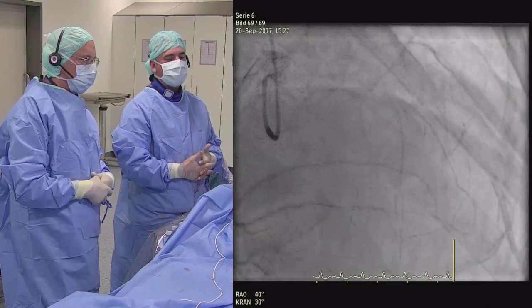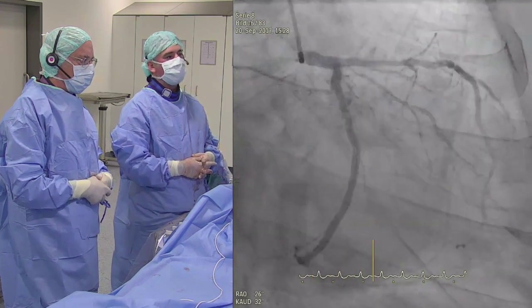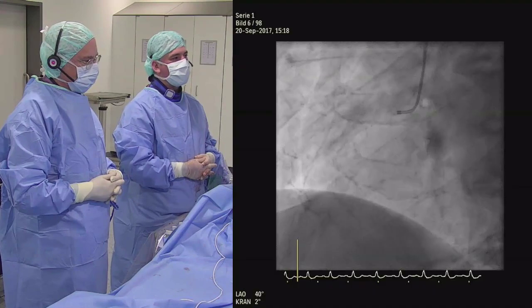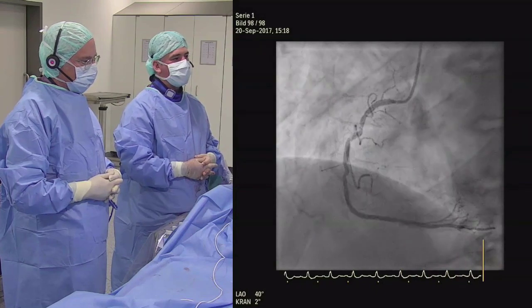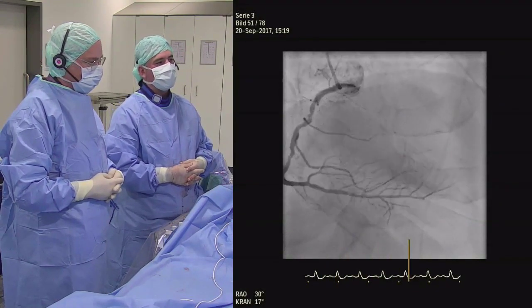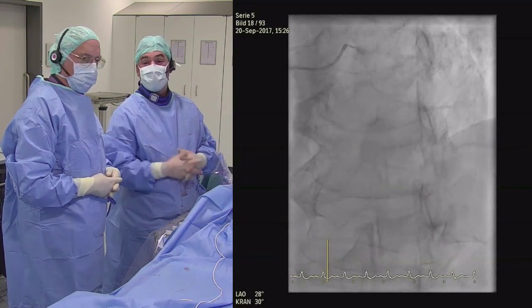To make a long story short, all of these optical transducers are basically produced in Quebec City, believe it or not. There are basically 3 companies at this time using optical transducer and optical fiber to transmit: the ASIST, which is a microcatheter that Dr. Diletti will discuss later on, the Boston Scientific one, and the Opsens one. The ASIST and the Boston are produced in a company which was developed prior to Opsens, and it's the same engineers who developed all of them. The funny story. Okay, so then there should not be that much difference.